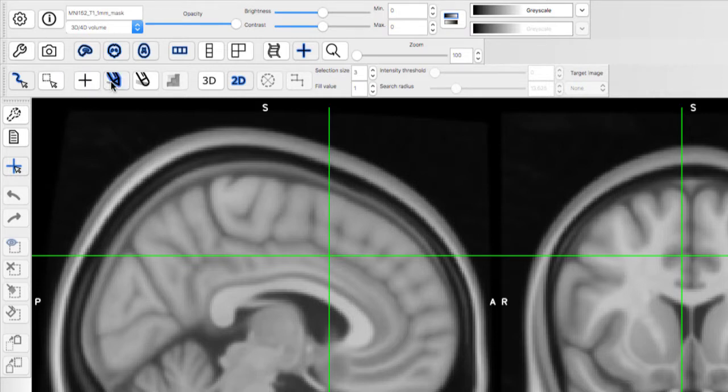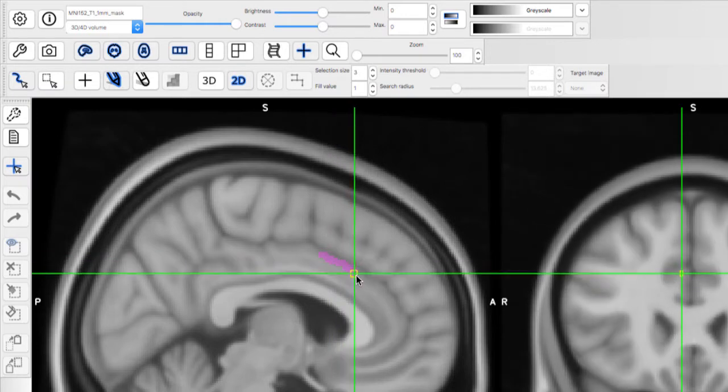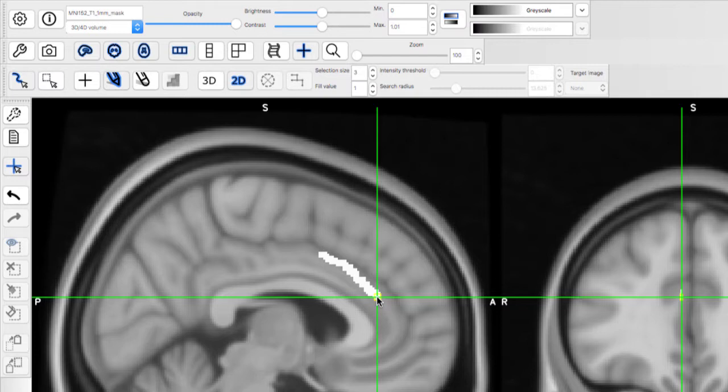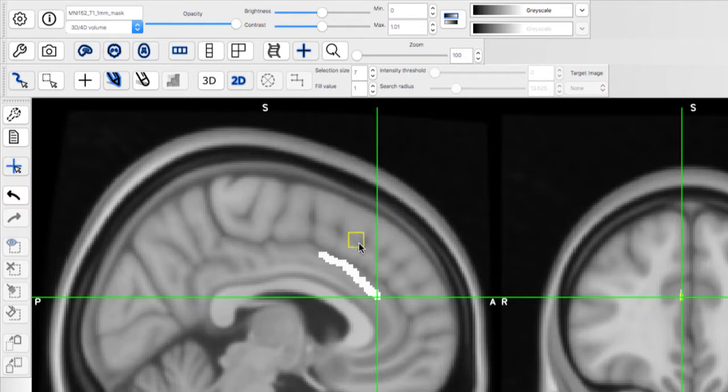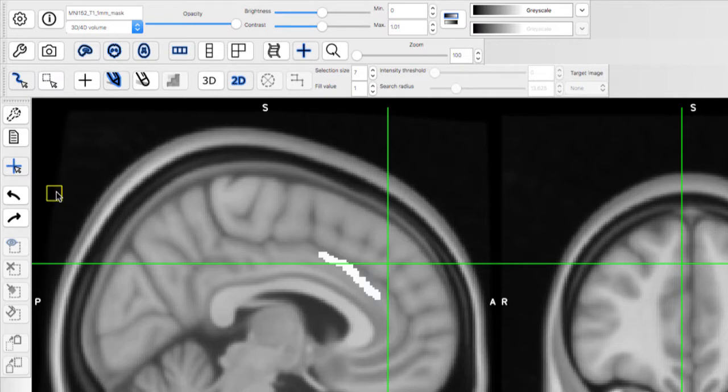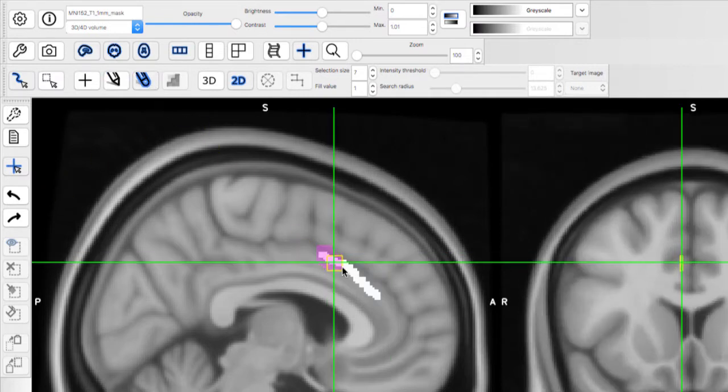If you click on the pencil, you can hold down the mouse button and start drawing. As soon as you release the button, those voxels will be filled in with the fill value. You can also change the selection size. You can remove voxels from your mask by either clicking the undo button or selecting the eraser button and highlighting the voxels you want to remove.